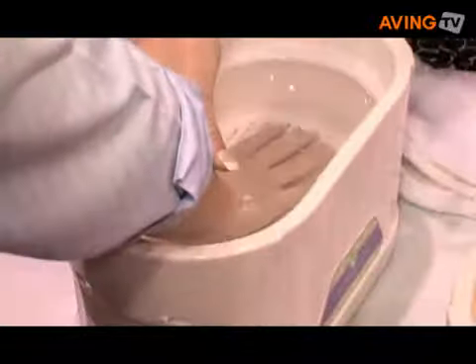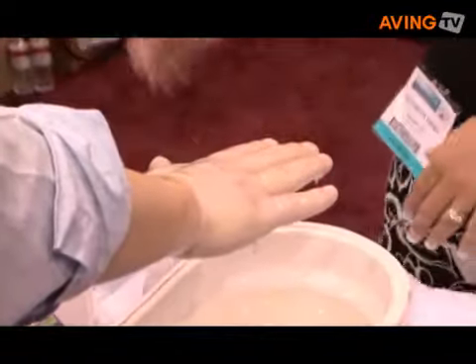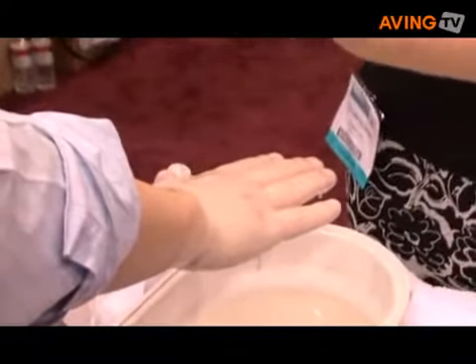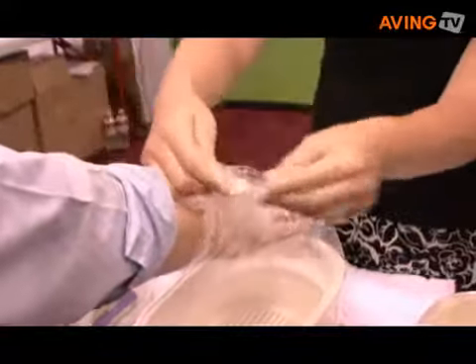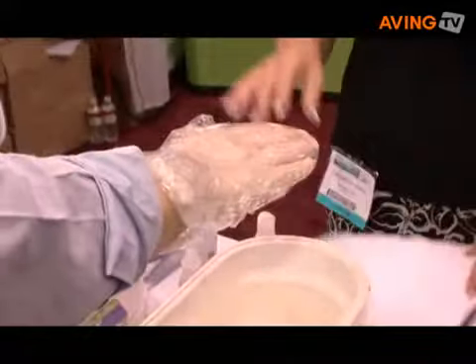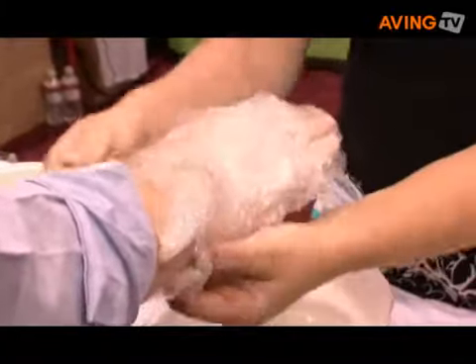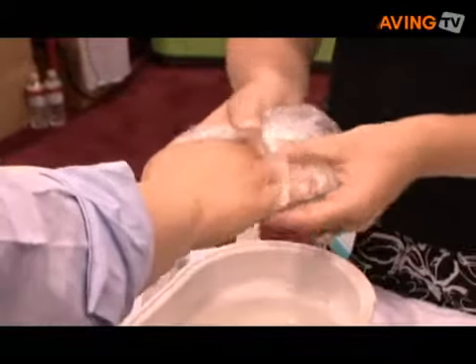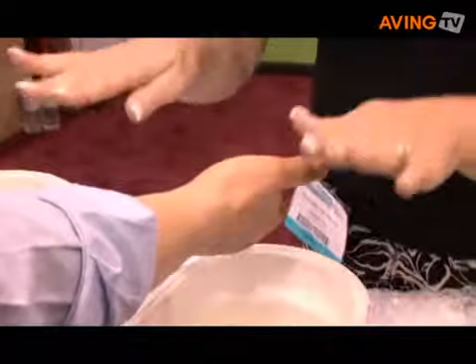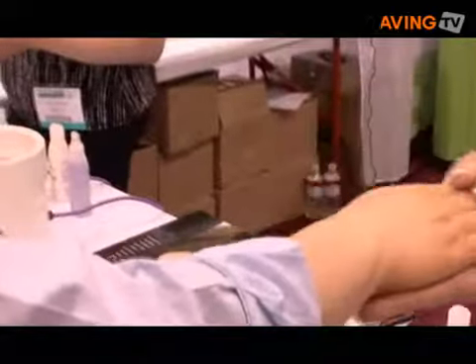And one more time. If you have arthritis pain, you may dip 10 or 15 times. I'm then going to wrap his hand with a plastic liner — this makes it easy to throw away the paraffin when you're done, and it also protects the insulated mitt that we'll put on. At the show, we leave this on just a couple of minutes. When you do a treatment, you may leave it on for 10 or 15 minutes in the salon, do a facial or some other type of treatment, and then the client can sit with the warm, soothing gloves on while they're having the other treatment done.